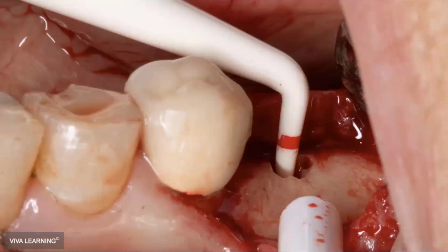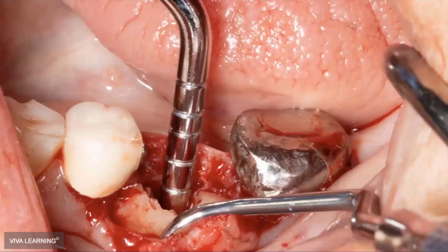So, I'm measuring with a probe. I'm measuring with these fatter instruments. This particular tool is from Nobel. So I think that first mark on the bottom is 7 millimeters. So you can see that I've got a pretty reasonably wide osteotomy that's almost at 7 millimeters deep.